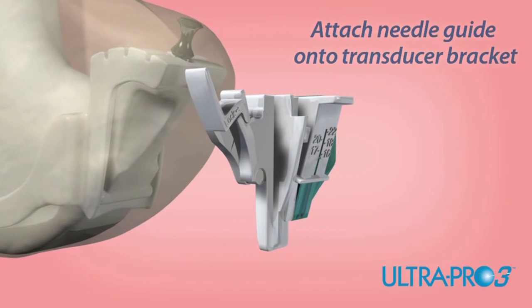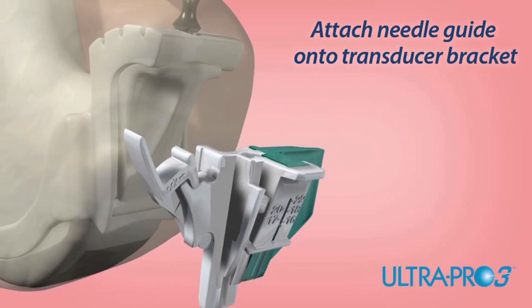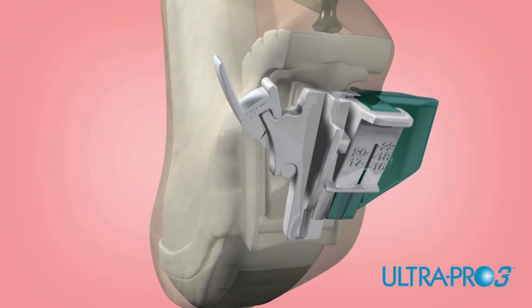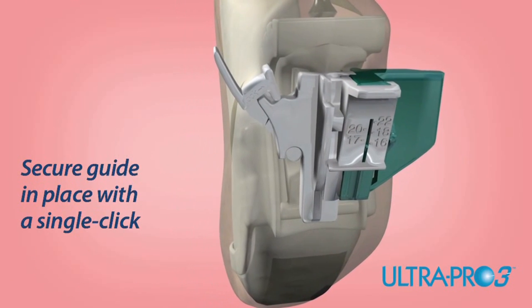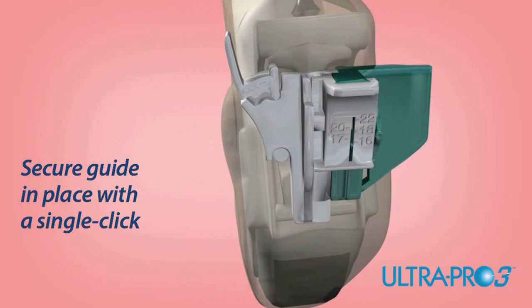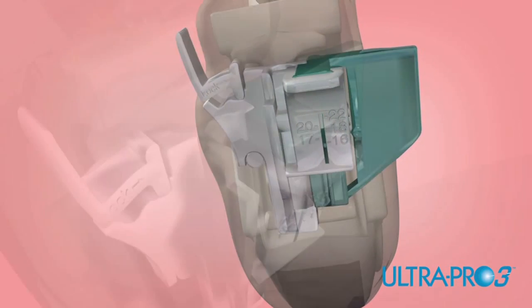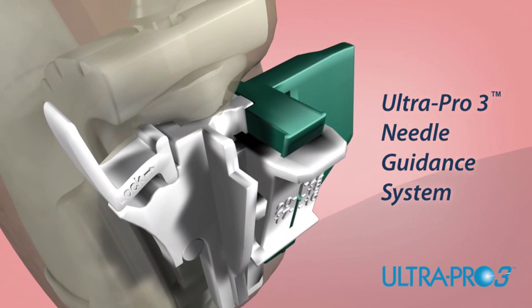Slide the disposable UltraPro 3 needle guide onto the transducer bracket. The UltraPro 3 needle guide features a robust lock for secure attachment to the bracket. Using your thumb, lock the UltraPro 3 needle guide into place by pressing the locking mechanism inward. Once the guide is secured, the UltraPro 3 needle guidance system is ready for use.